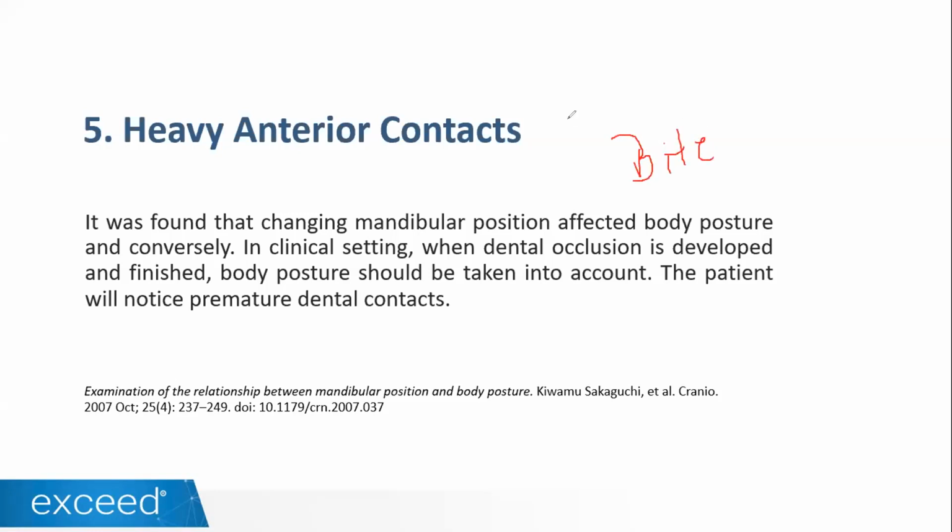The bite registration for the ones that are taking scanning impressions, well, you know that when you take that bite registration, the patient is lying down. They have their heads towards the back. So just do this exercise. Just put your head towards the back, bite hard in there with your teeth, and then move your head towards the front. Try to put your chin towards your chest. You're going to see how the occlusal contacts change from that position towards the front position.